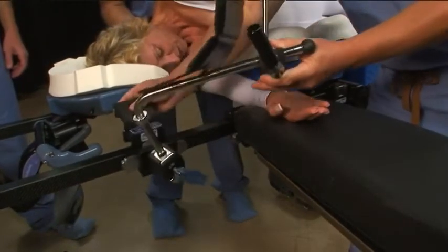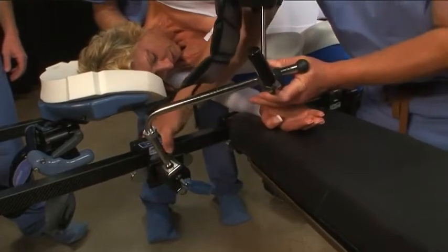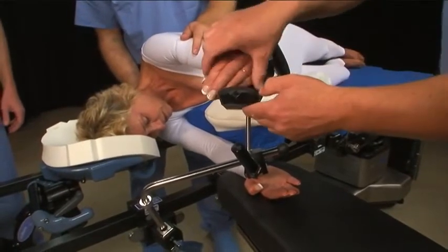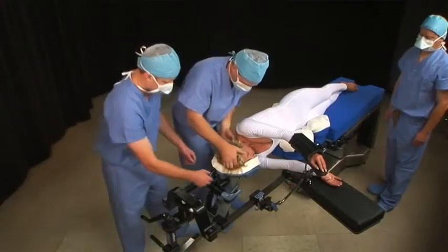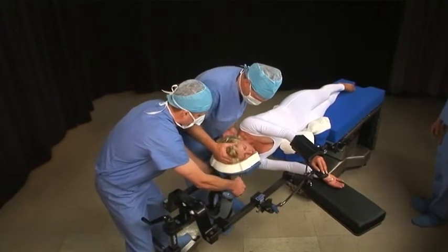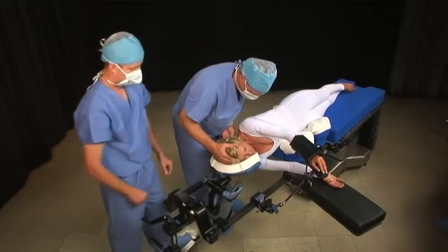Attach a prone arm board to the frame. Position the patient's upper arm on the forearm support. Adjust the C-Flex so that the patient's head is fully supported and no part of the headpiece protrudes past the patient's chin into the neck. Apply light pressure to the C-Flex to ensure that it is locked.